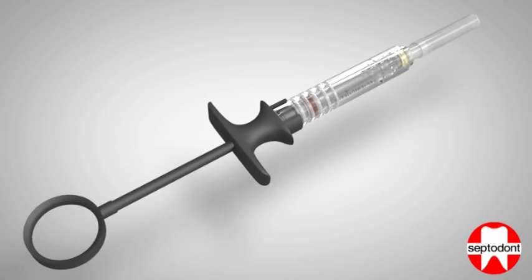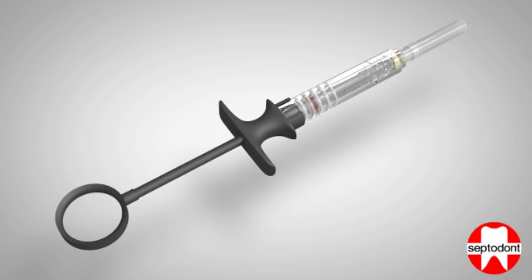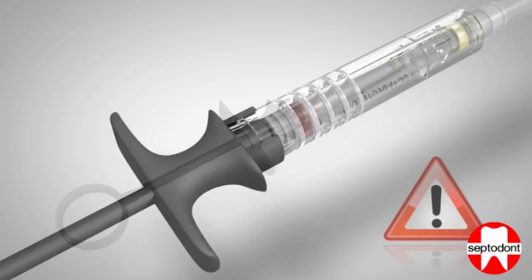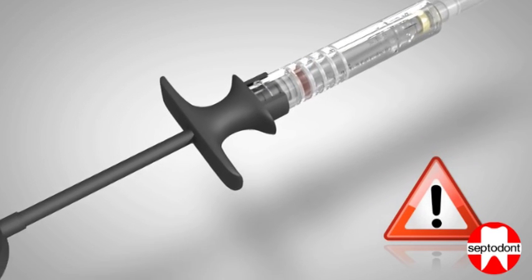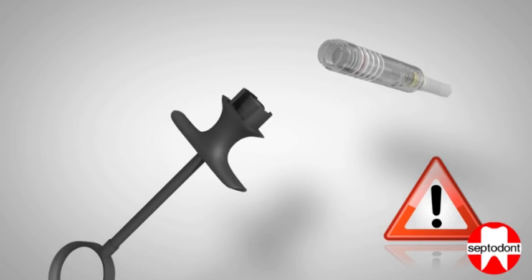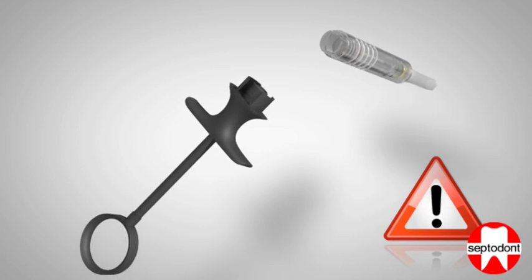Make sure that there is no gap between the transparent sheath and the handle. Please note that failure to retract the sheath fully until you hear the click may result in the device disassembling during use.